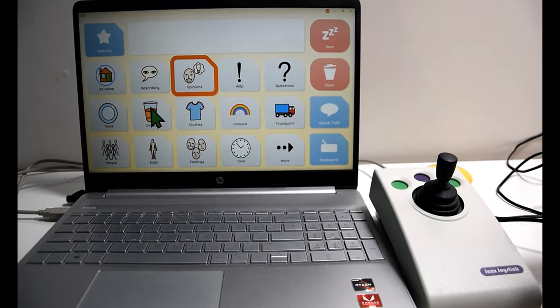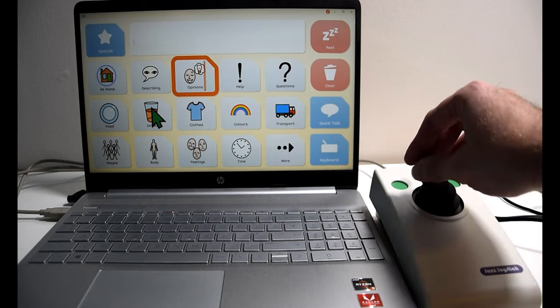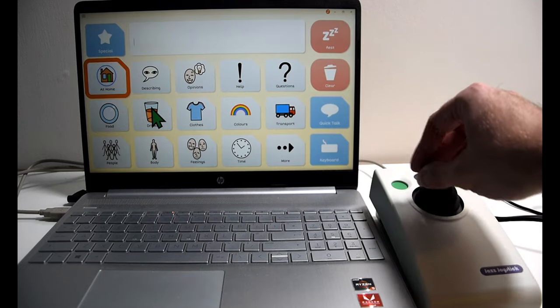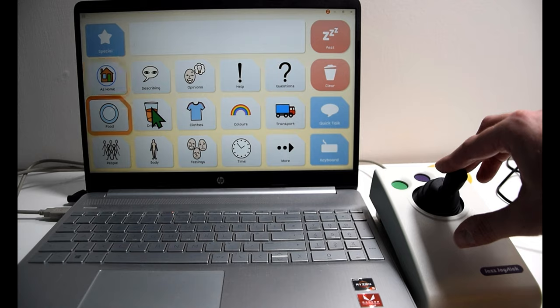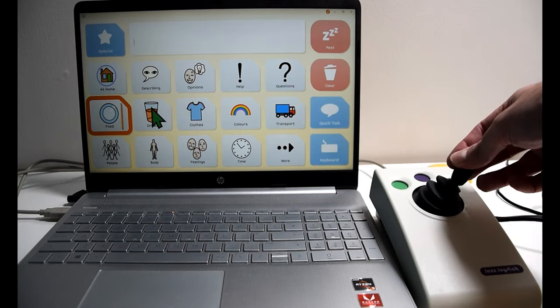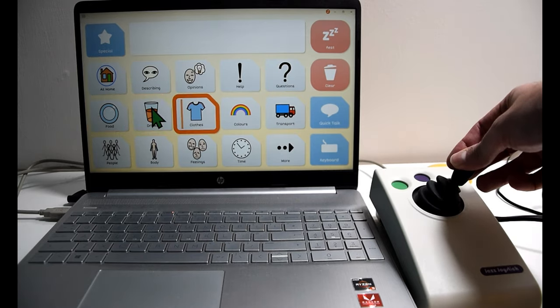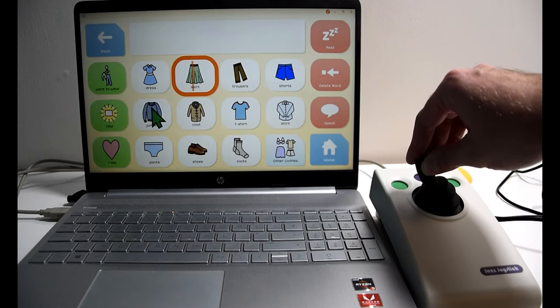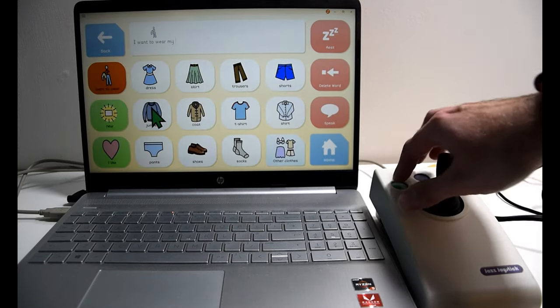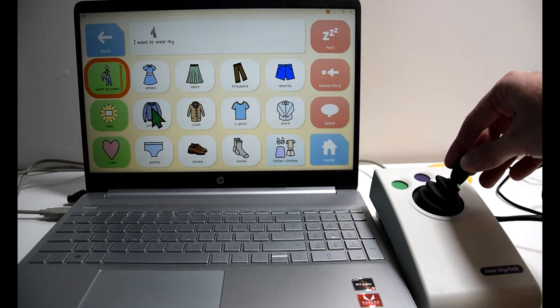What we should see straight away is that this becomes a scanning device. As far as using it in Grid goes, it's as simple as selecting what you need to use, going in, and selecting the sentence you want to say.